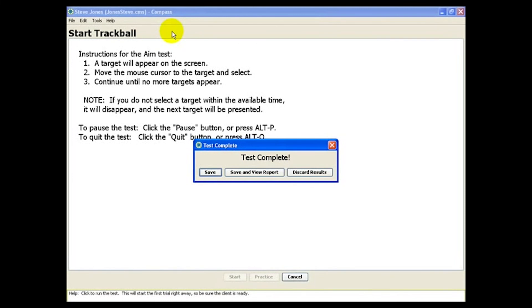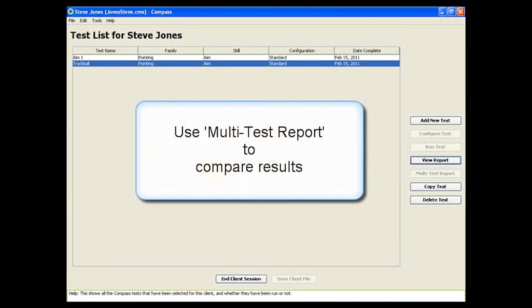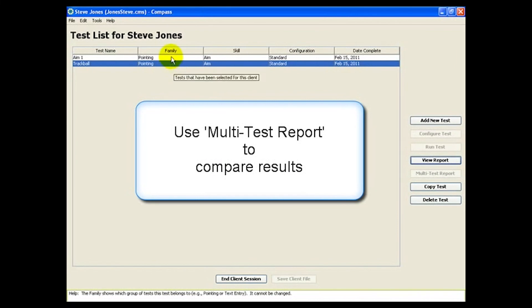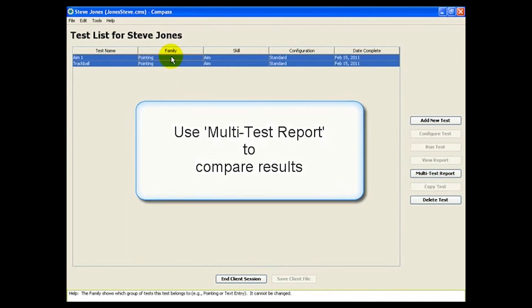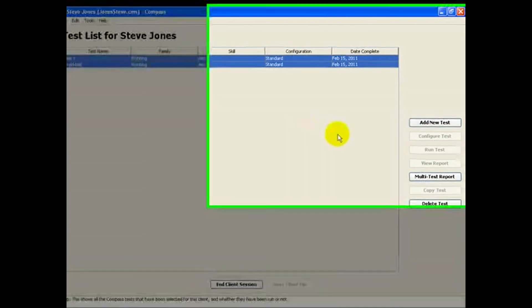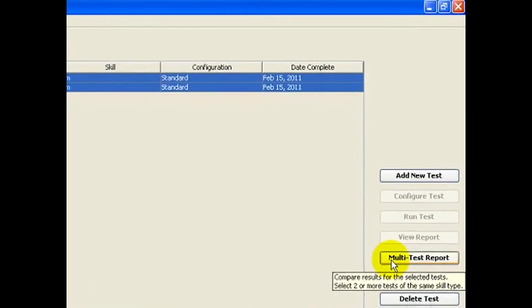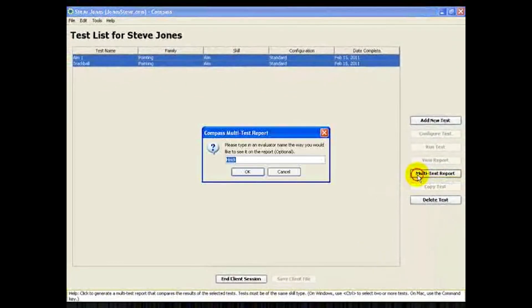At this point, we can view the report as we did for the other test, but here's a really neat feature that makes it very easy to compare the mouse to the trackball results. Just select the tests you want to compare, then click Multitest Report.